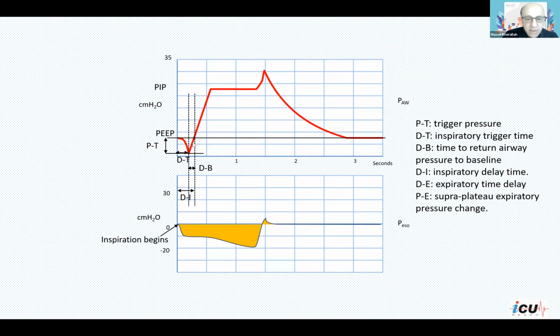But after that, you see the positive pressure here. What you don't see on the ventilator is the negative pressure of the patient. You can see here how the patient continues to drop the inspiratory pressure. This is the intrathoracic pressure, and without an esophageal probe, you cannot measure the intrathoracic pressure. So this is something that you don't see unless you have an esophageal monitor and the probe is connected to a pressure diaphragm, and then you transmit that pressure to the monitor.